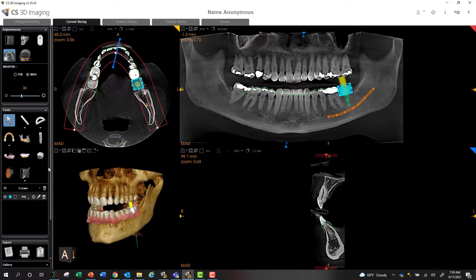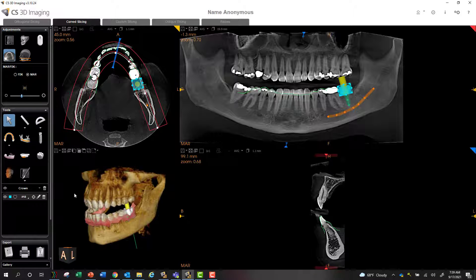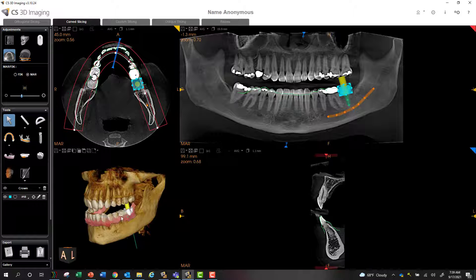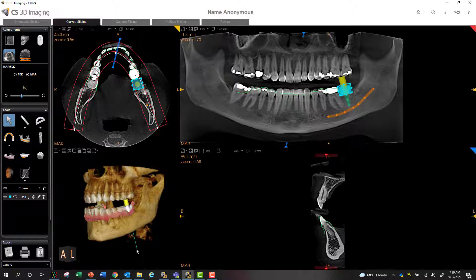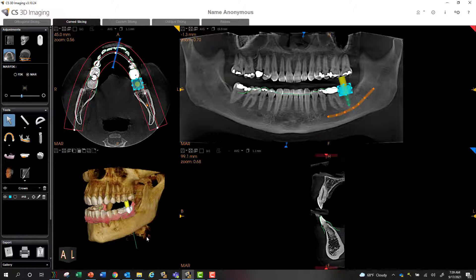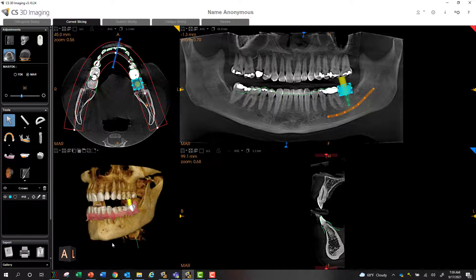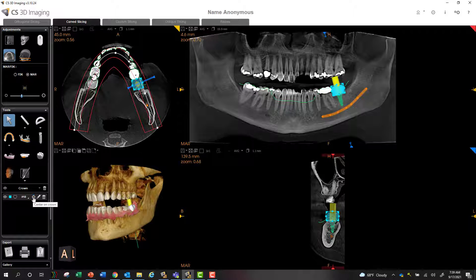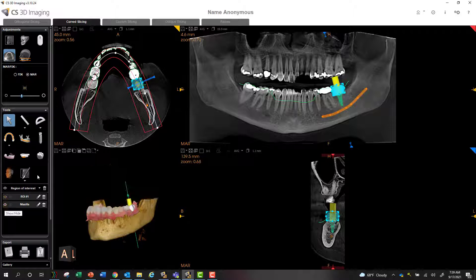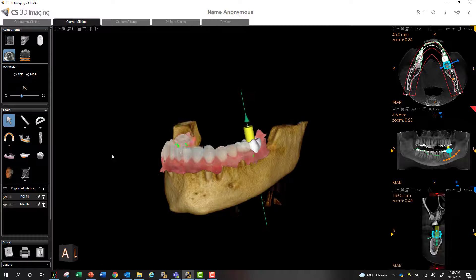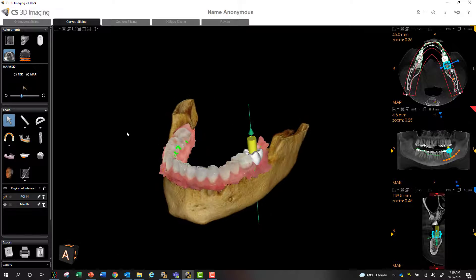You can see I've already got the case planned. This is that scan off the 9600. We've got our merged digital impression scan, our crown planned already, and our implant and nerve mapped. Let's go ahead and center all of our views on our crown, and you can also just kind of create a little region of interest to visualize the case a lot better for your patients.